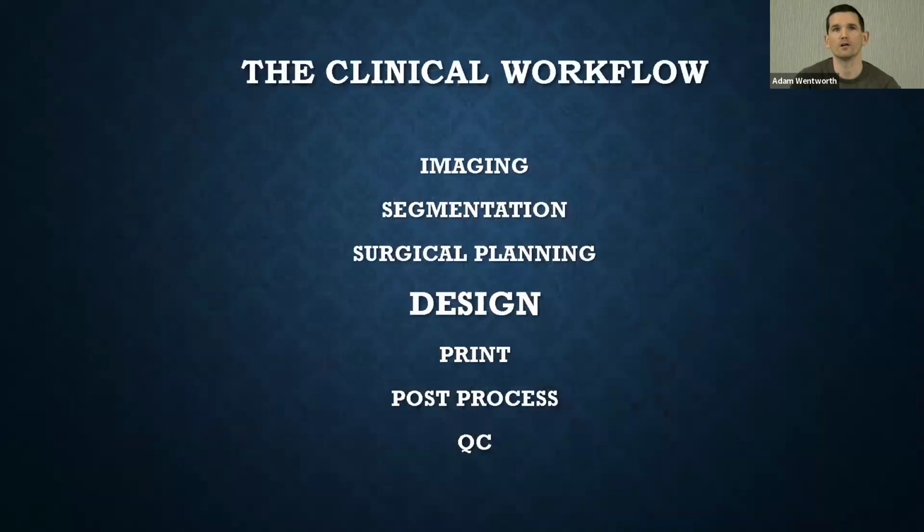And so here's the clinical workflow. You can see that I've enlarged design. Design is that critical piece where we're limited by technologies of imaging and 3D printing, but also needing to meet the user needs of the surgeons for a variety of different applications, especially tying those needs to folks who don't necessarily know what 3D printing can offer. So we're torn between a few different places, and design is sort of that critical aspect of, there's a little bit of subjectivity in how an engineer might design a specific part for a specific application, and hopefully automation can sort of nail down the critical factors of any one of those designs, or a workflow that gets really well established to help define it well.